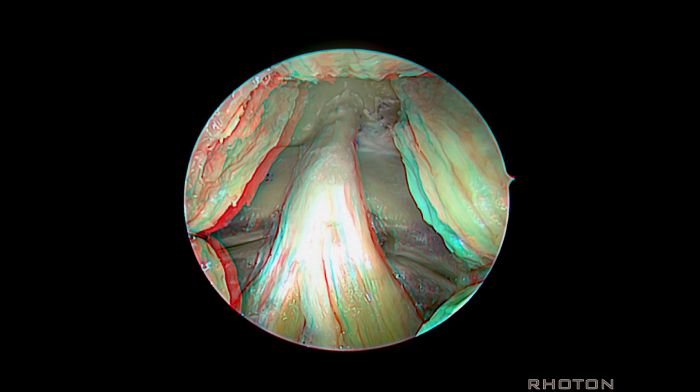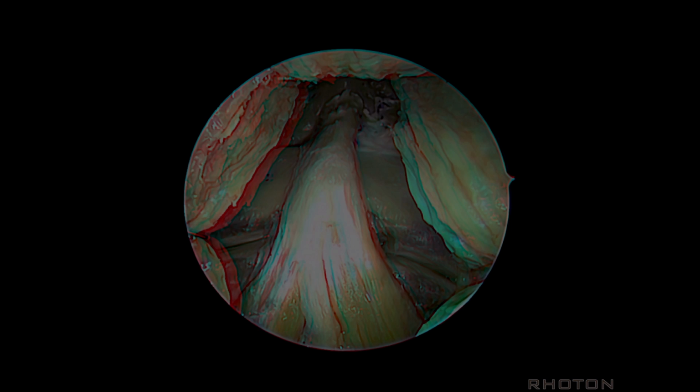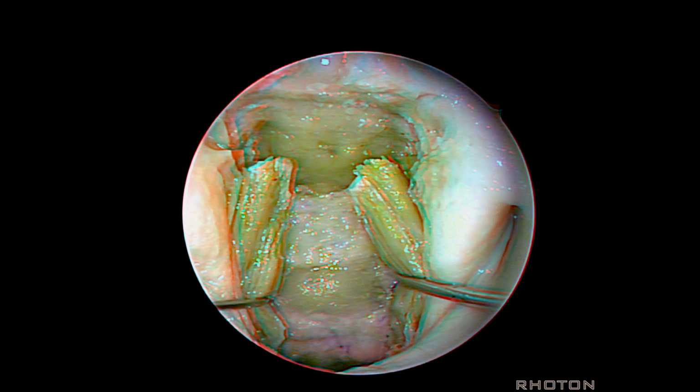But this is the transoral approach, and to get this view up to the clivus, we even have to angle the view upwards, while if you come in transnasally, you're looking straight ahead at longus capitis, clivus, C1.